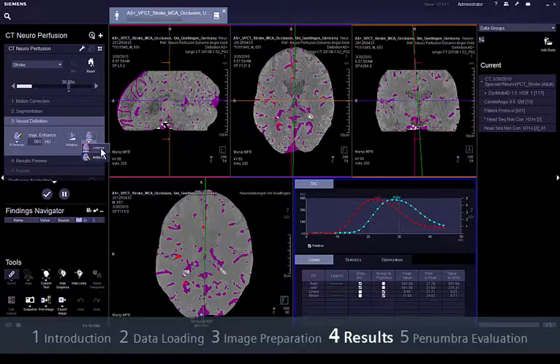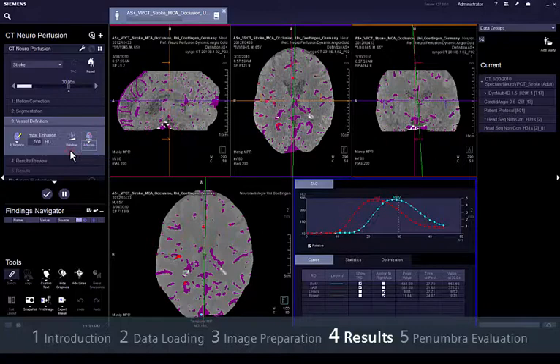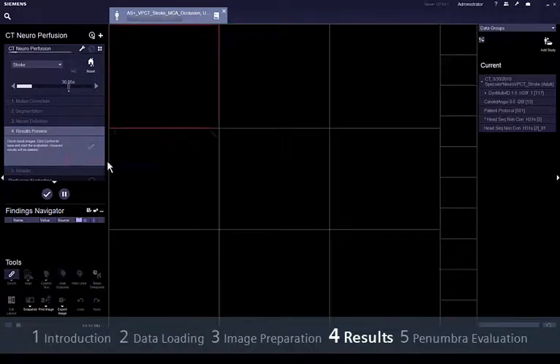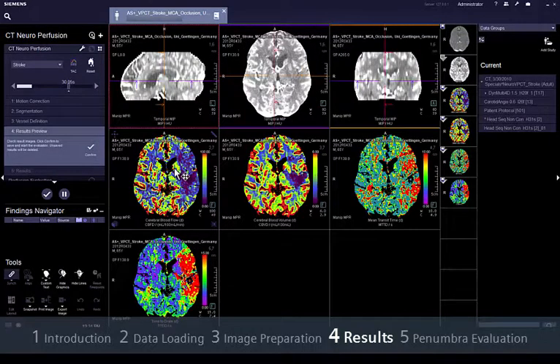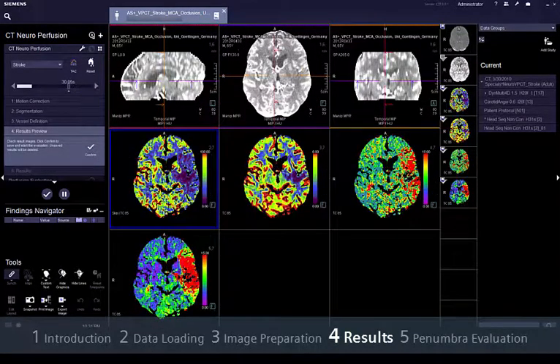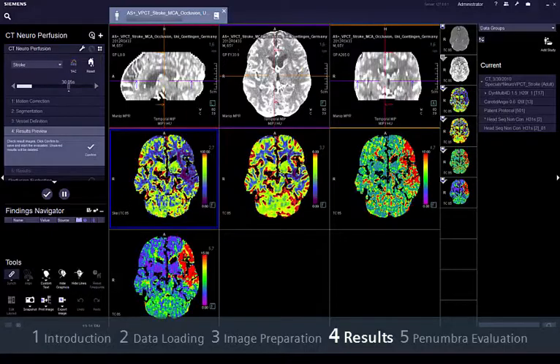If you are satisfied with all inputs in step 3, go on to step 4, results preview. In this step, you can quantitatively assess the result volumes to ensure that they are adequate for further evaluation and archiving.